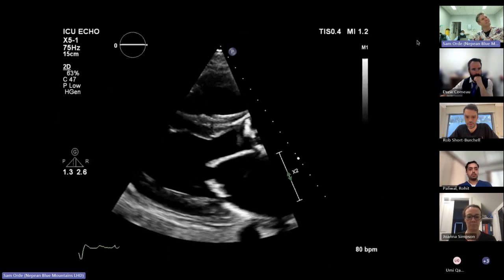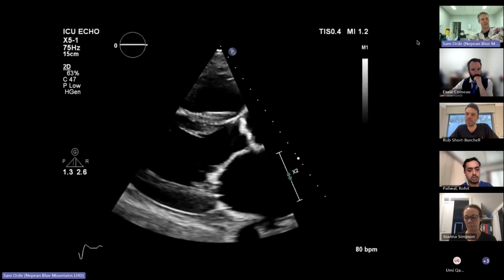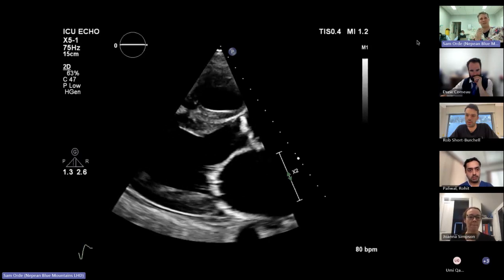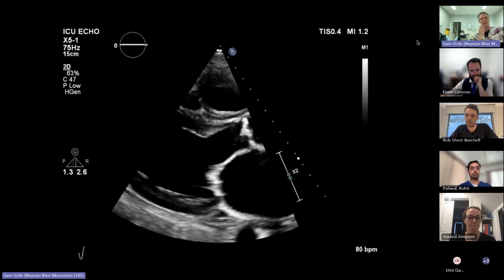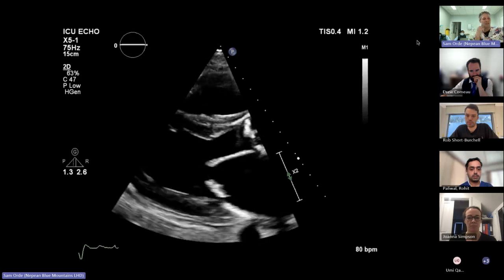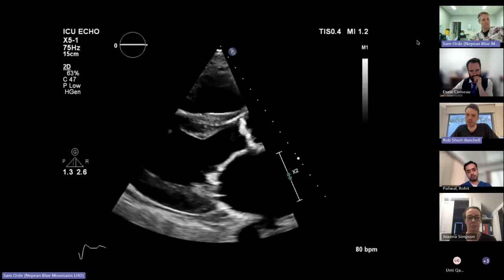You talked about being concerned about the left ventricle. I think with our language, I don't know if this is not pass or fail, right? I think try and keep the language tight. Of course, we're concerned about it, but you said it on the next one. It's like saying significant LV systolic dysfunction that you said for the apical 4 one. I mean, it's moderate or severe. Take your pick. Either of them would be fine. I agree. I think it's severe. So just say this is severe, abnormal. Just make a call. Okay.